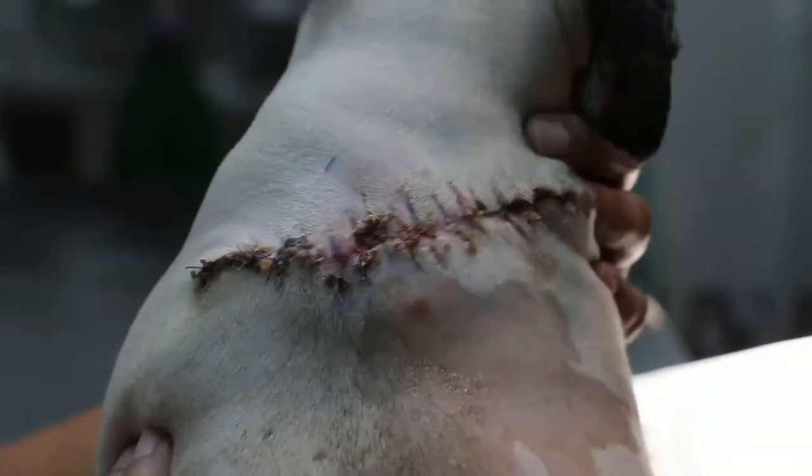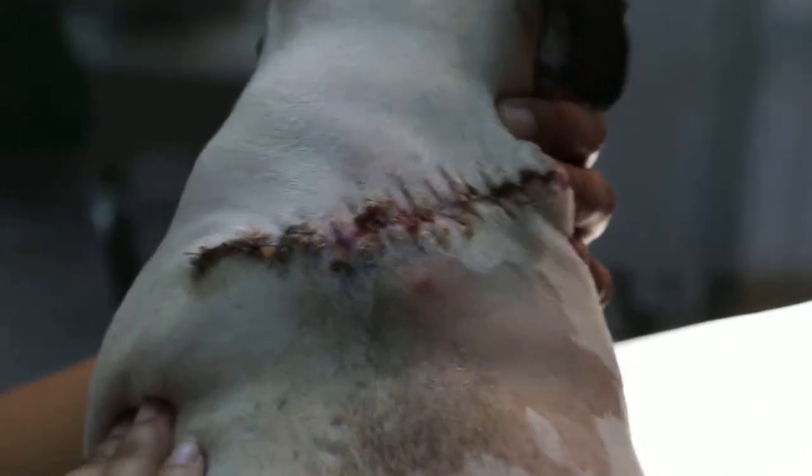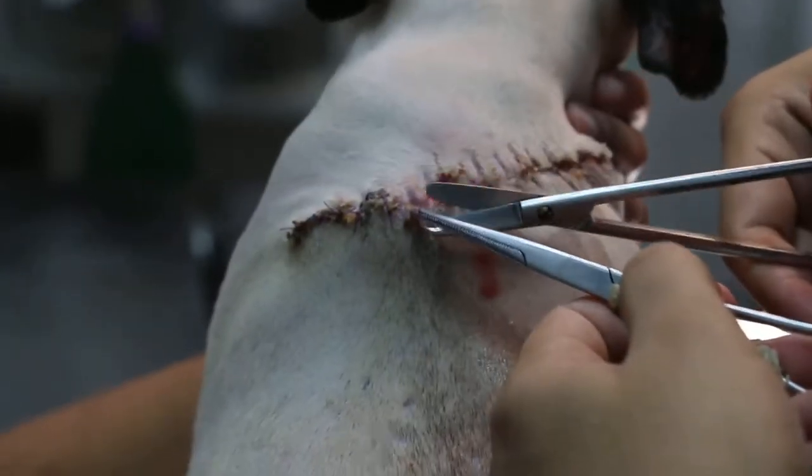It's about 10 days ago the operation. They removed a big fatty lump. So now we take out the stitches and then drain off the pus by making a bigger hole.